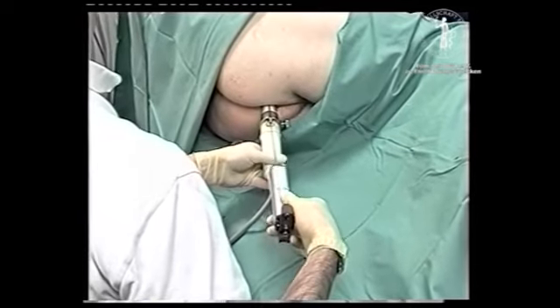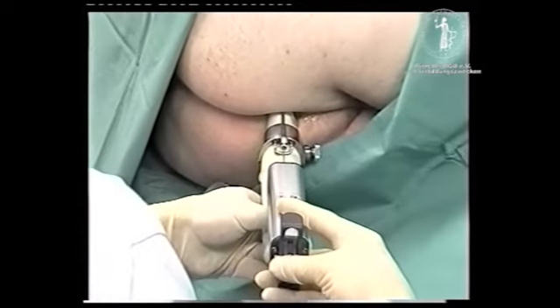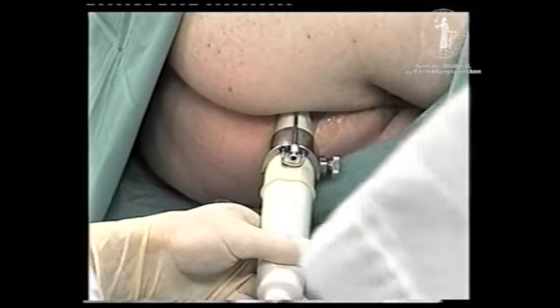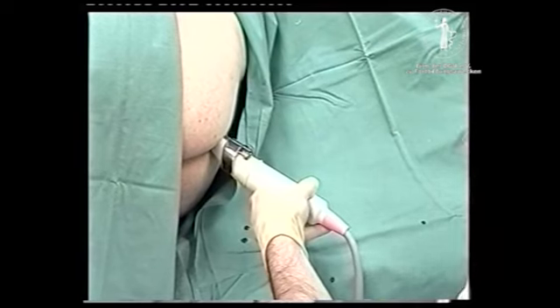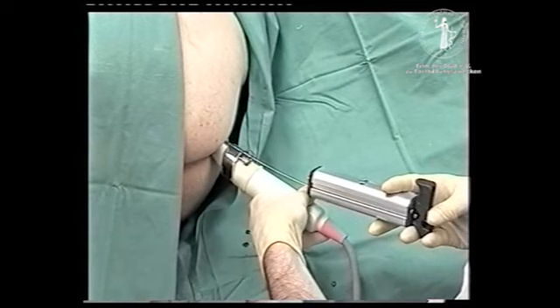After having allowed the anesthetic to unfold its effect on pain sensation, the routine 10-core TRUS-guided prostate biopsy procedure is started. 5 biopsy cores with a true-cut needle launched by the biopsy gun are taken from each lobe of the prostate.